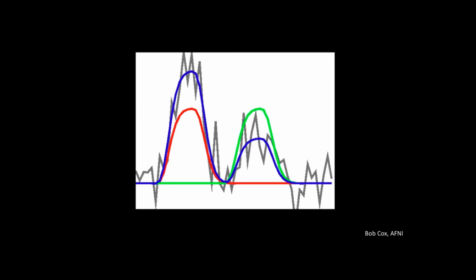And once we do that, we can test for whether it's a significant effect or not. So ultimately, it's the beta weights you do the statistics on. Yes, the beta weights is what we do the statistics on. And usually, you want to take a contrast between the two, controlling for some sort of dimension or variable, so that you can isolate some kind of process of interest.